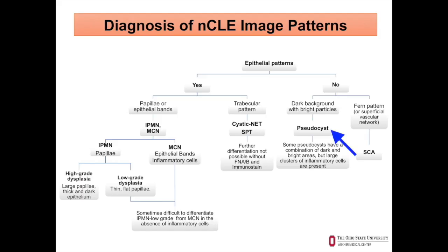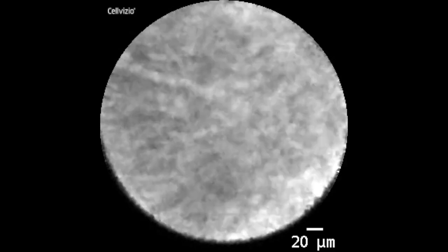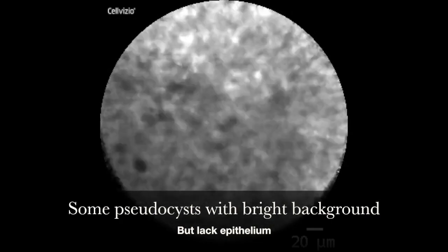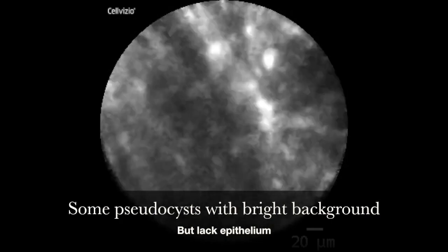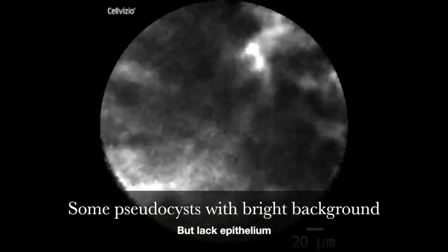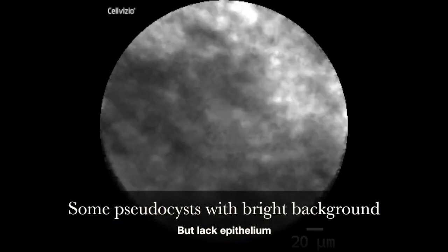The last cyst type we will review are pseudocysts. Pseudocysts generally have a dark background with bright particles. The inflammatory cells, typically macrophages, can show autofluorescence. Some pseudocysts though have a very bright background. As seen in this video, you also see poorly organized groups and clumps of inflammatory cells against a bright background.